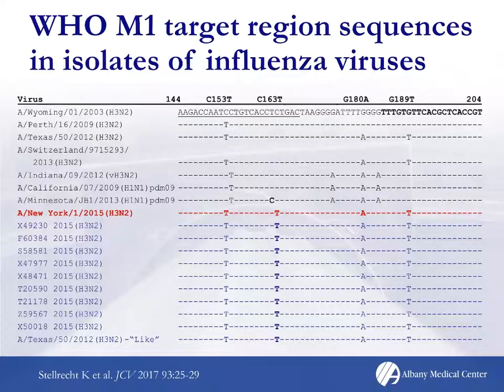They actually had only 3 mutations, and these 2 were identical, which was kind of surprising because those 2 viruses that New York State had identified as Texas-like or Swiss-like performed differently with the assays. So we sequenced the Texas-like sample that we obtained from New York State, and actually that virus in the matrix gene was more like our viruses.